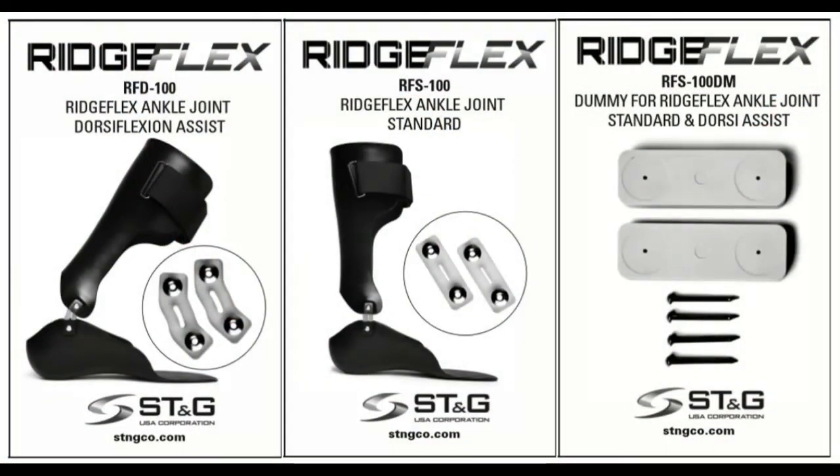The Ridgeflex comes in different designs. We have the RFD-100, which is your dorsiflexion assist. We have the RFS-100, which is our standard joint — it's straight. And then we have our molding dummy, the RFS-100DM. It's really cool.